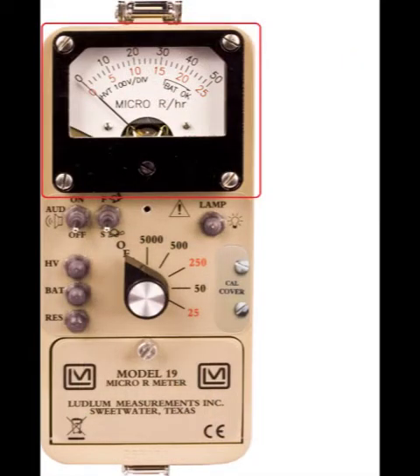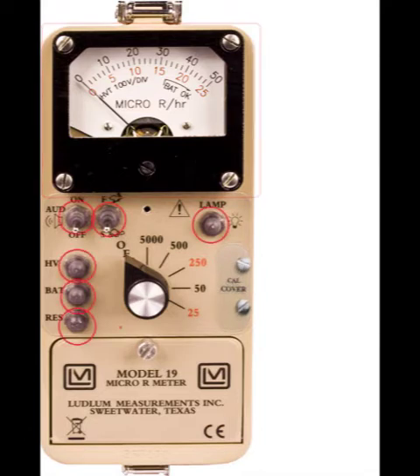The meter movement is housed in a rugged aluminum bezel with water-resistant seals. All controls are located on the front panel, and the front panel switches have rubber boots to help seal out moisture and dust.